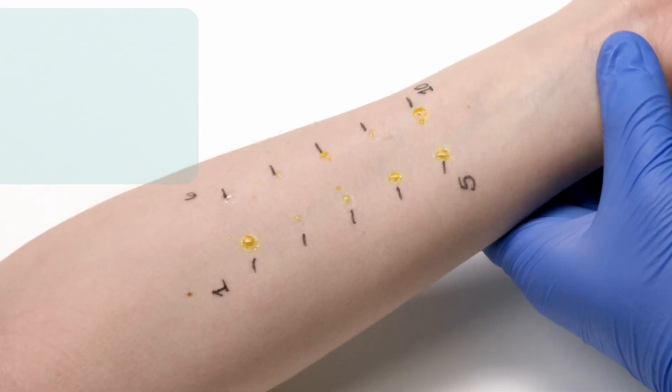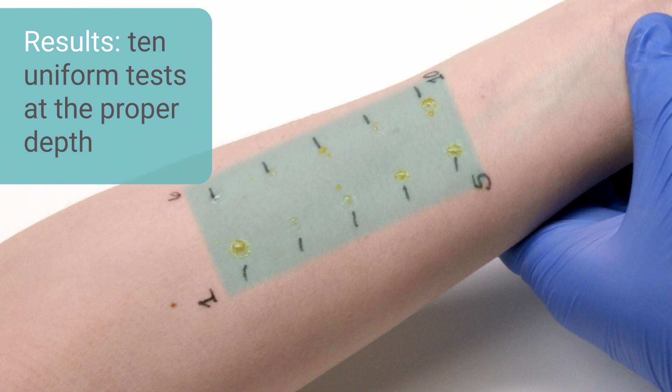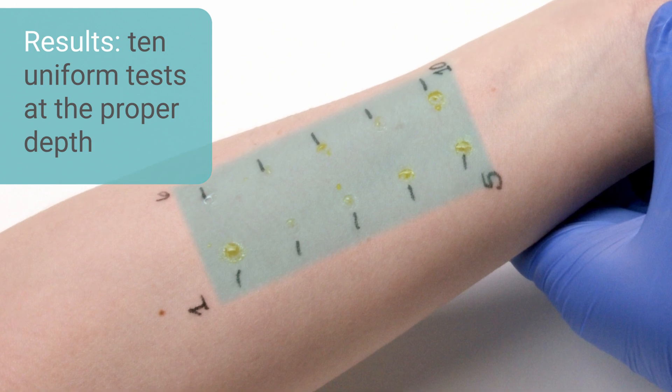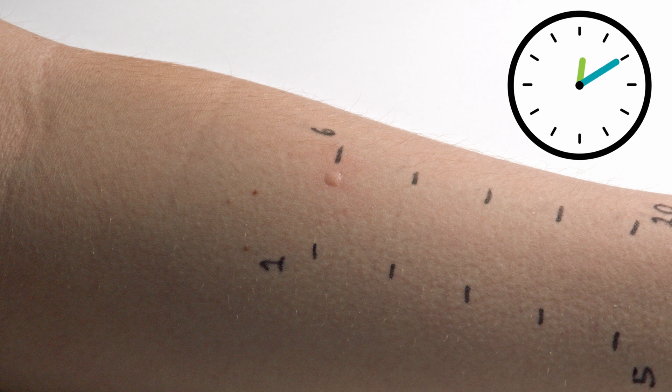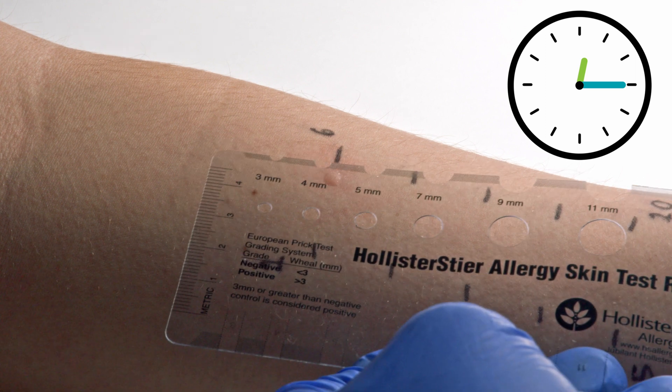When used as described, the Comforten device will produce 10 uniform skin tests each at the proper depth. Within 10 minutes, the histamine positive control can be read, and at 15 minutes, the allergens are ready to be evaluated.